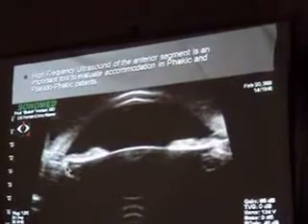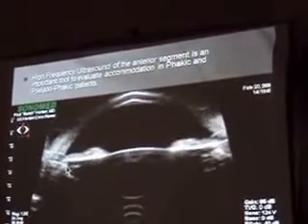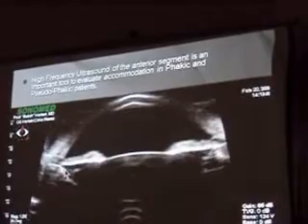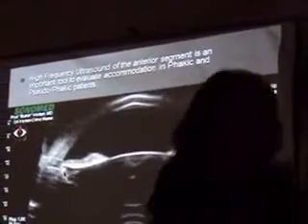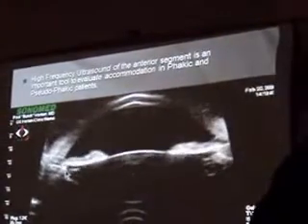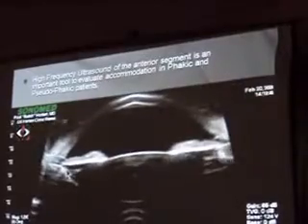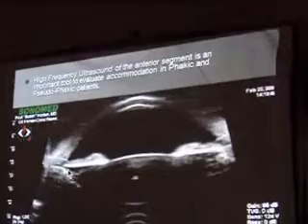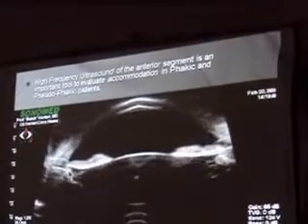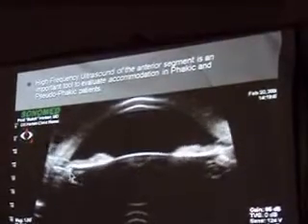The anterior capsule is the first one you are going to remove doing a cataract surgery. Means in order to replace that accommodative ability for the patient, keep in mind that you are just taking out probably the structure that is moving the most during the process of accommodation.